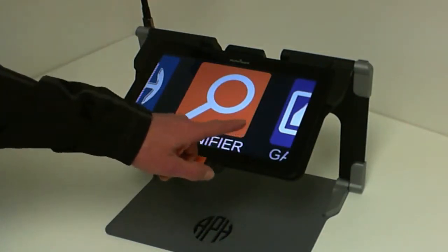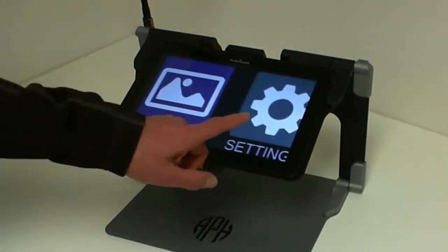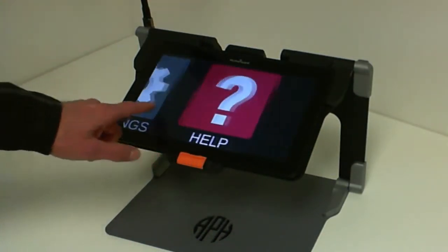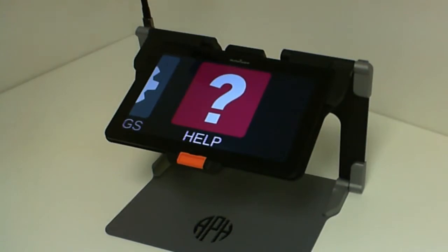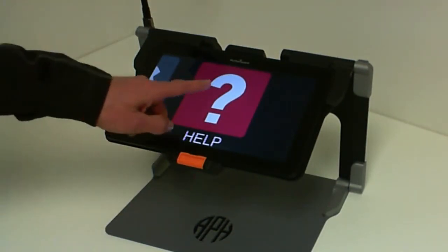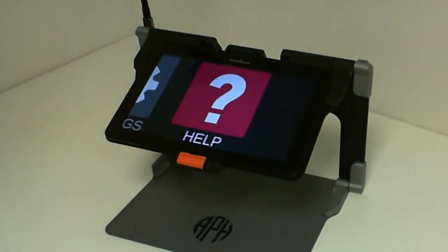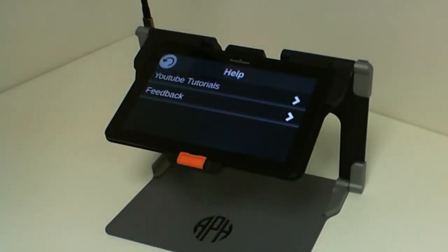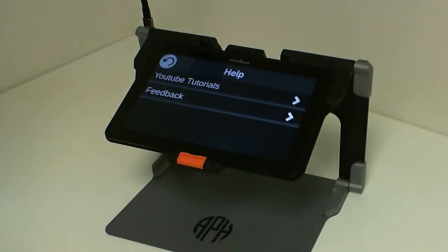It is situated at the far right of the main carousel of Prodigy. Once you enter the Help application, there are two options: either YouTube tutorials or feedback.